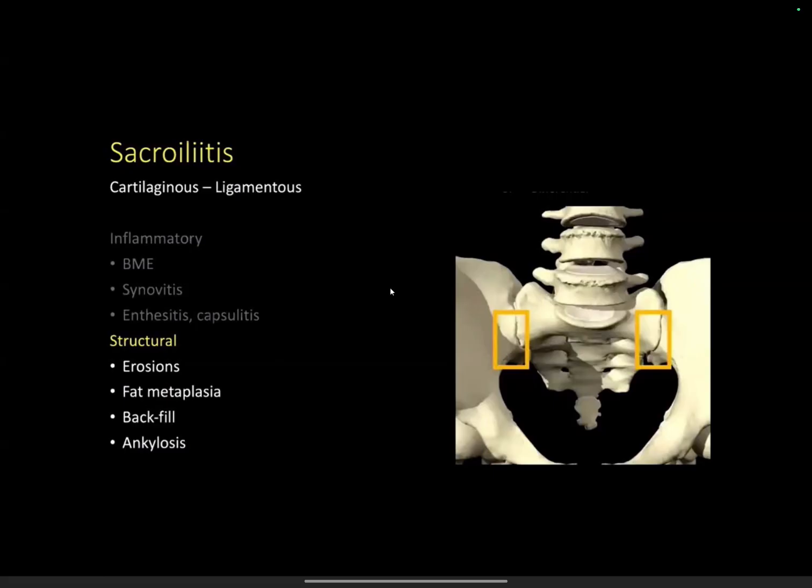Yeah. Then the next question is, in a normal spine, we also see the shiny corner sign. What is the importance of that? Probably that should be reported, and while taking the history, the rest of the SPA features should be evaluated. It could be an early disease marker or could be not related. Both are possible. Shiny corner sign does not always lead to SPA.